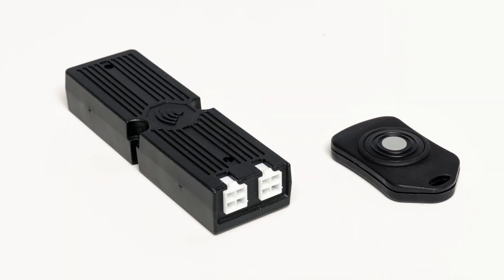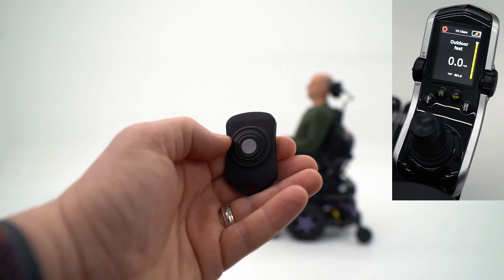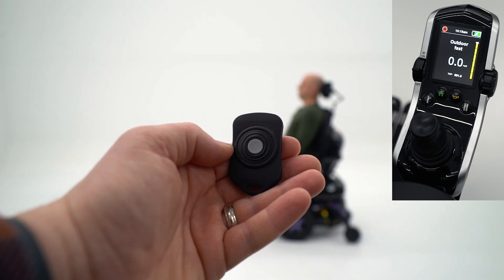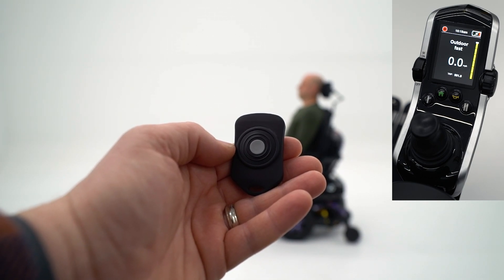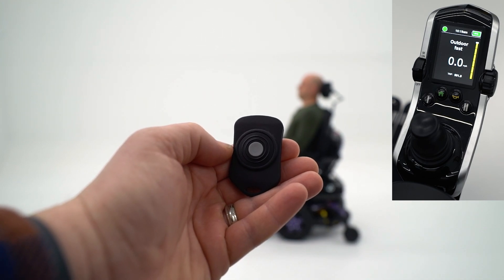The Quantum remote stop switch consists of a receiver that mounts to the power chair and a remote fob that, when activated by a caregiver, stops the chair. When activated, the power chair enters a drive inhibit status until the fob is pressed again, resetting the system into a normal drive status.